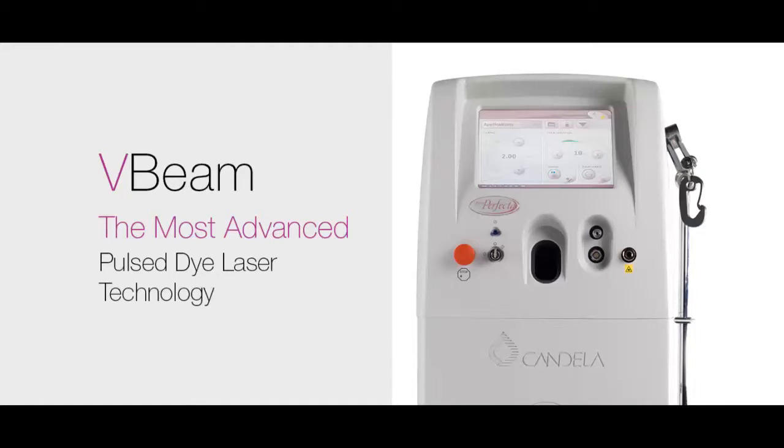The first randomized controlled trial on the use of pulsed dye lasers in the treatment of inflammatory acne vulgaris was published in 2003. The study utilized subpurpuric doses, resulting in significant reduction in total and inflammatory acne lesions, 49% in PDL treated versus 10% in sham laser treated patients with a low incidence of adverse effects.